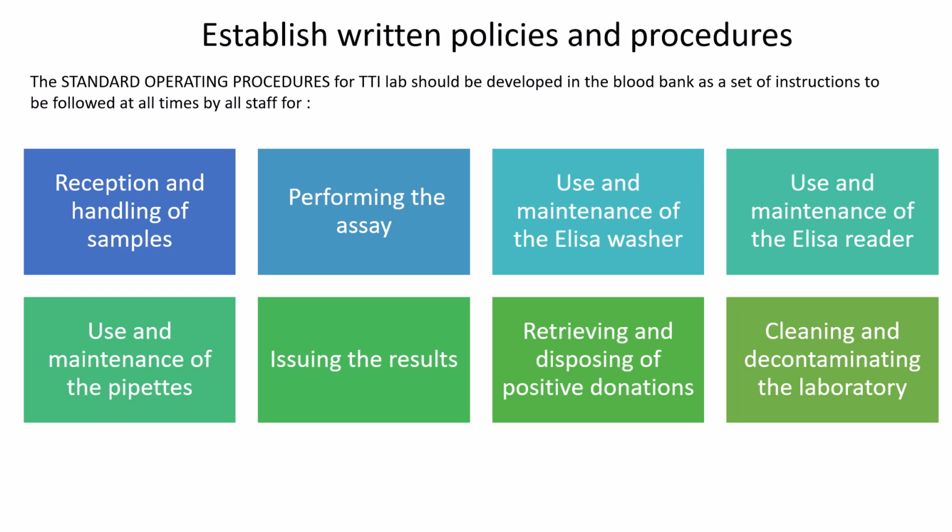Here I'll talk about the ELISA. We have to use and maintain the ELISA washer, ELISA reader, and we have to use and maintain the pipettes, issuing of the result, retrieving and disposing of positive donations, and cleaning and decontaminating the labs.